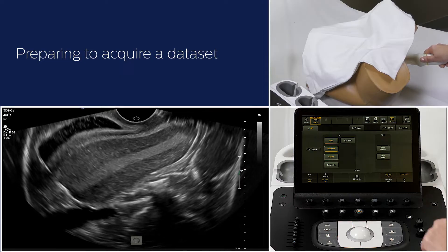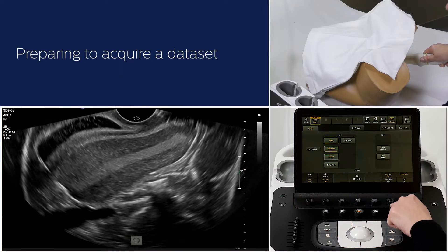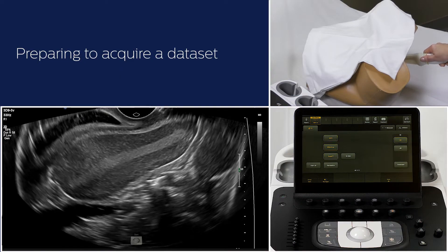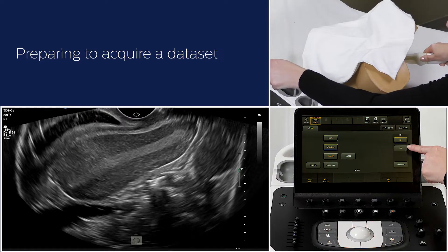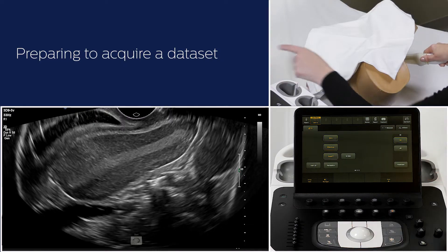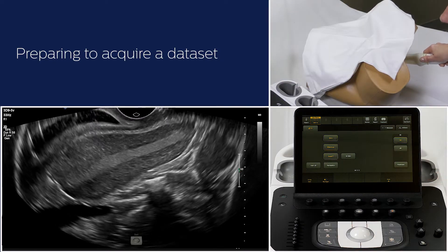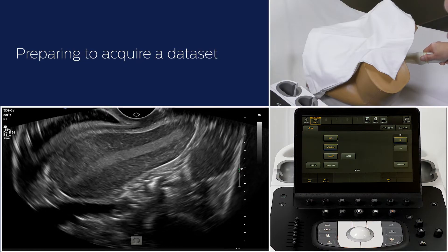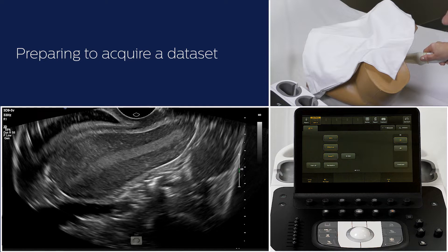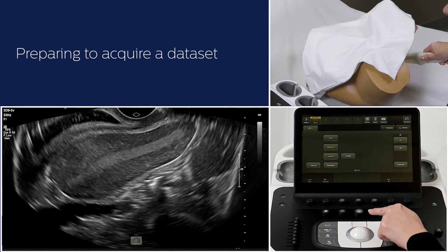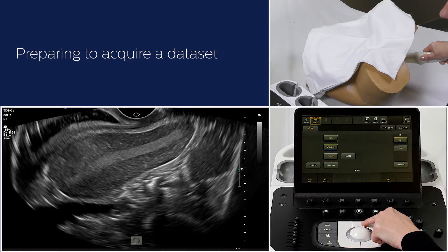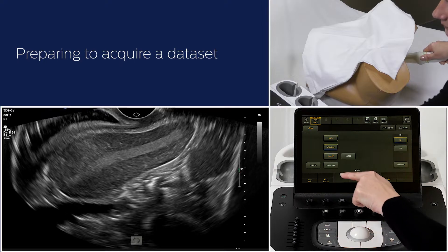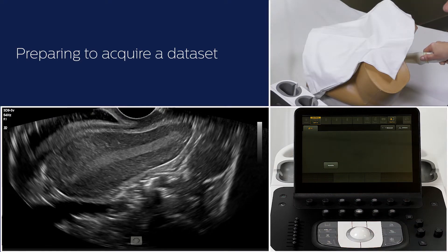Now, push the 3D knob. On the touch screen, you can select 3D or 4D. 3D is selected by default. By default, there is no region of interest or ROI box on your image. You can acquire a 3D data set immediately by pressing the middle button above the trackball or Start 3D on the touch screen.